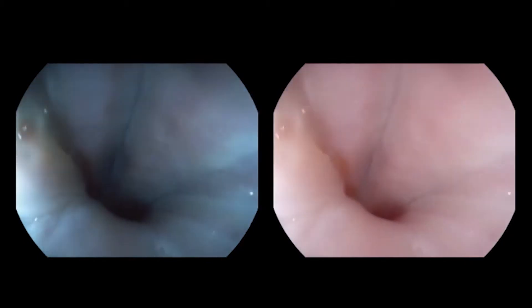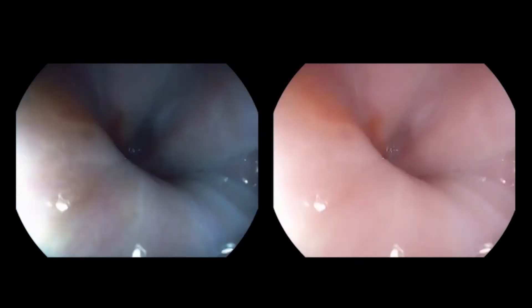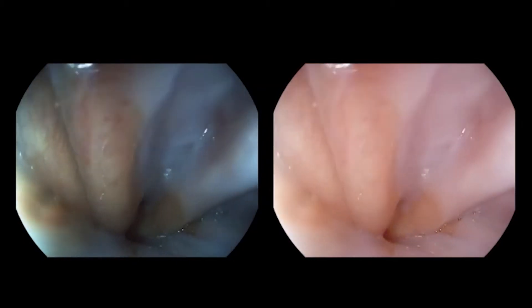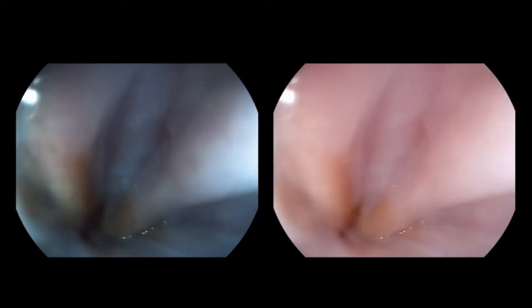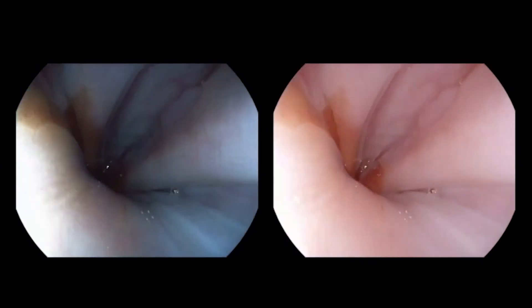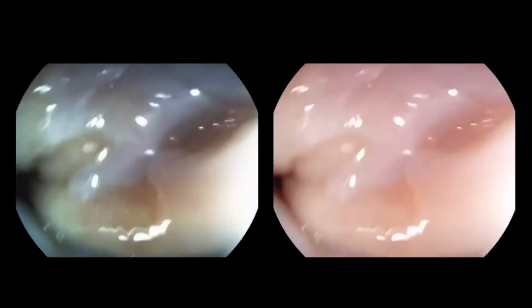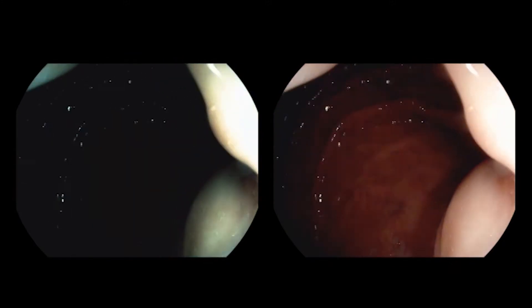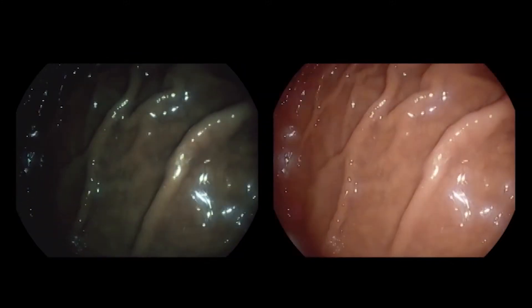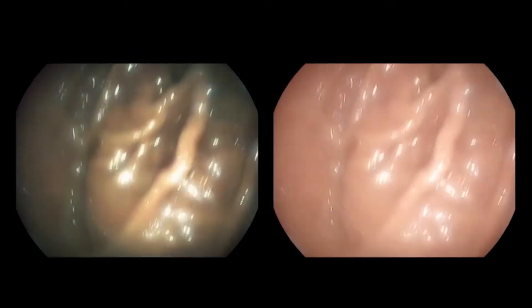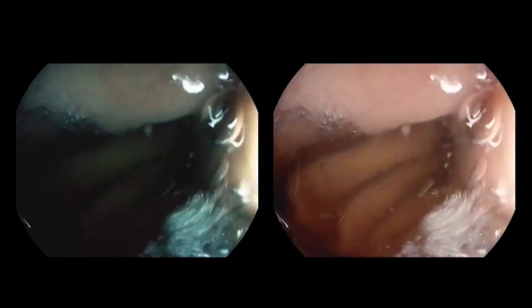Spasticity in the distal esophagus is obstructing good visualization of the Z-line here. Air is therefore suctioned out of the stomach, so that a better view of the Z-line is obtained during withdrawal.